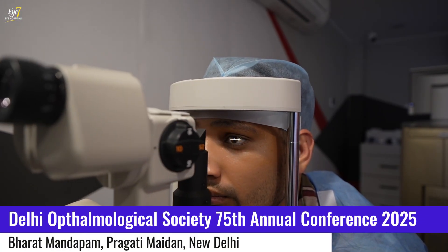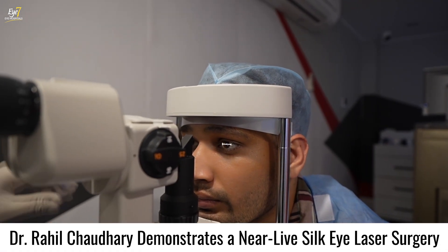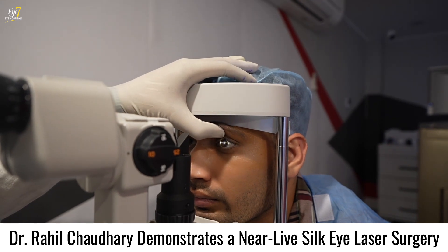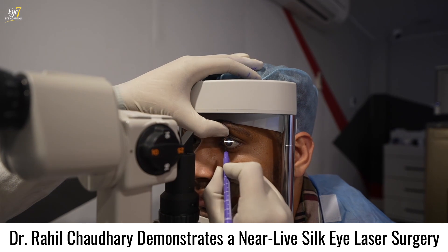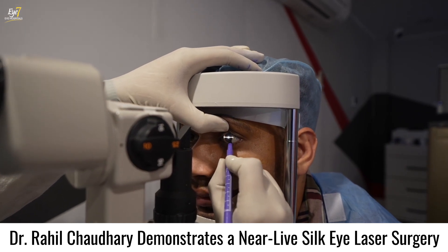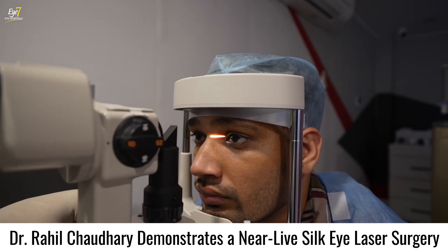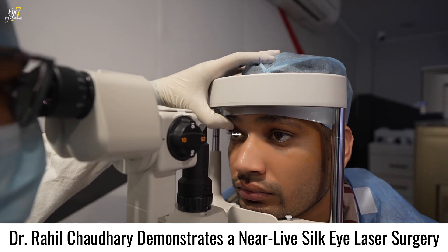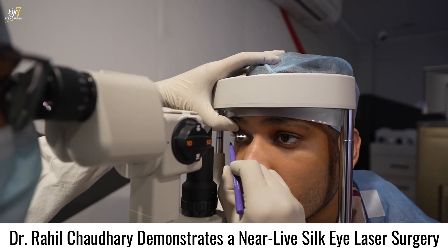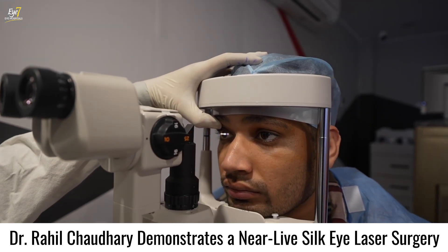I am demonstrating the latest refractive lenticule-based procedure, which is the SILK procedure. We start with marking the toric axis for the patient. At the moment the cyclotorsion is manual, but very soon we will have automated cyclotorsion in the Irita machine. Using the slit lamp to do the marking is very convenient. Before marking, we make sure that the slit is perfectly bisecting both pupils and the head is nicely aligned.